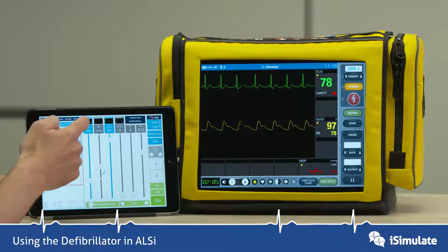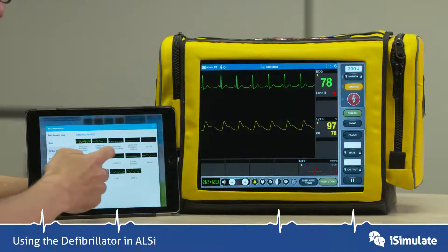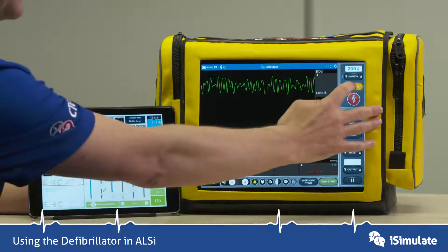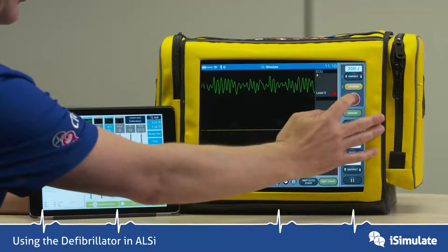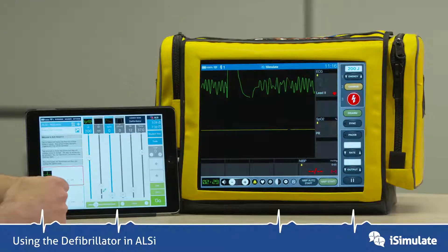Let's put this into a shockable rhythm — let's go into a VF. So we're now in VF, and what will usually happen is you would charge it by pressing the button here, and then you can press shock, and it gives a shock type waveform on the screen.